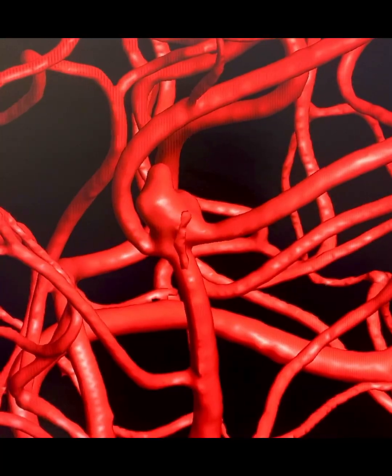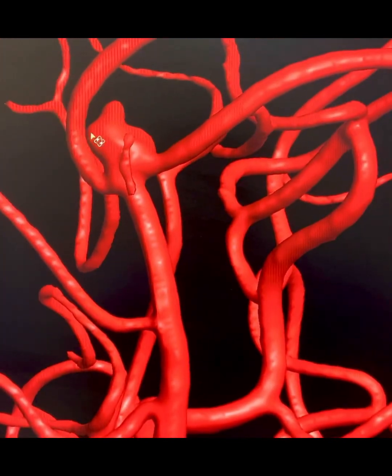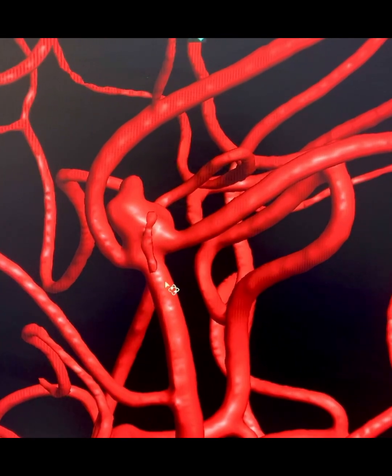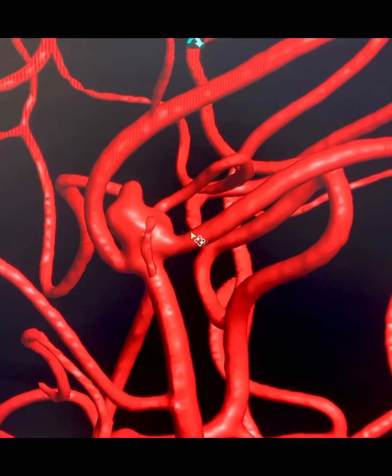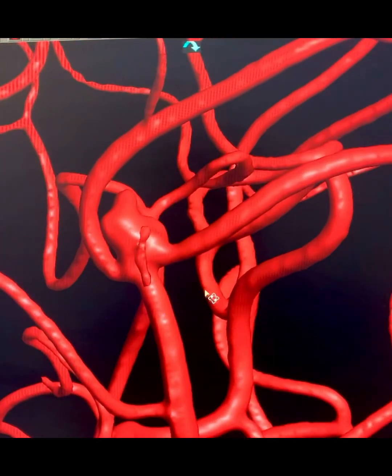So here is the 3D rotational angiogram reconstruction. We can see the DACA aneurysm here, and this is the ACA, and these are a couple of branches just coming out of the base of this aneurysm. So this is going to be a little tricky as far as treatment is concerned.